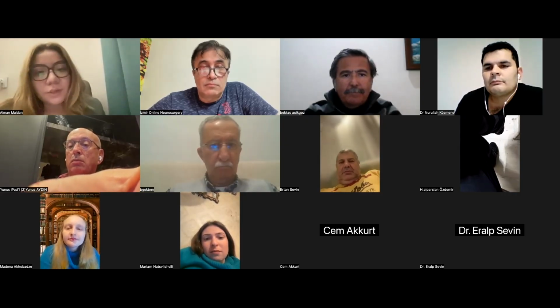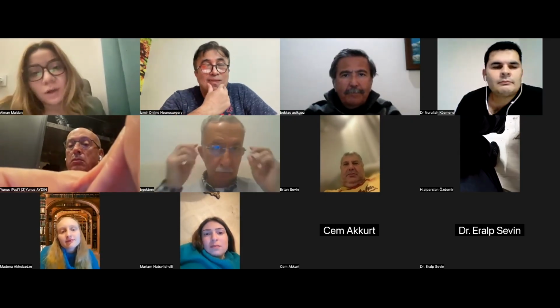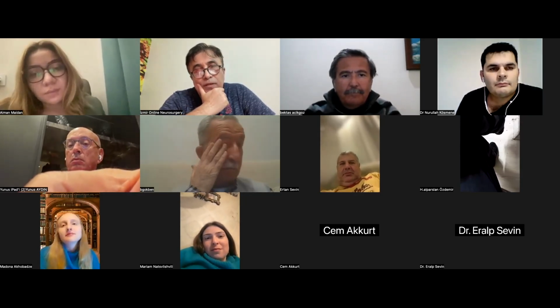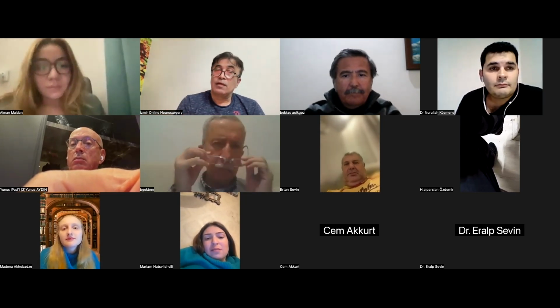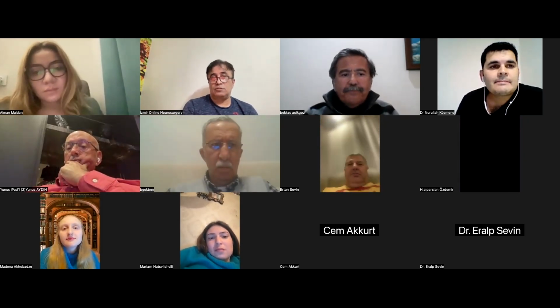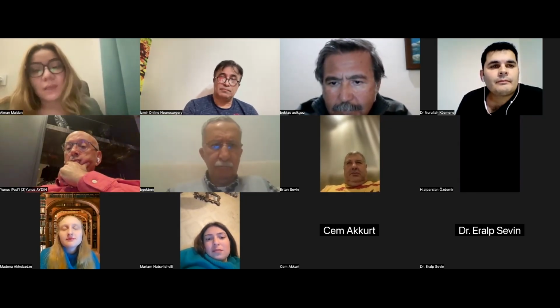And in your experience in İzmir Atatürk Hospital, how long do patients stay? We have started the uniportal transforaminal endoscopic discectomy actually less than 1 year ago, and we are very happy with the results. We discharge the patients on the same day or at most the next day. Next day, after the surgery.